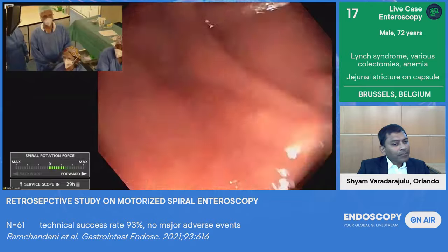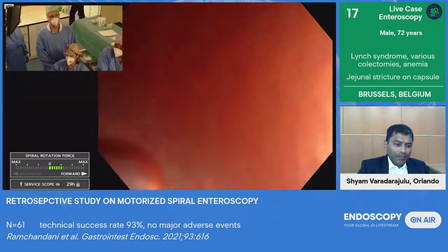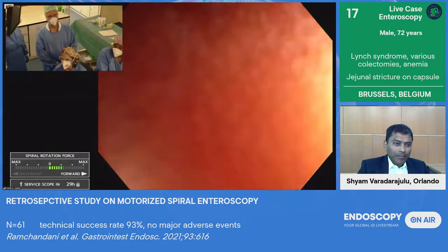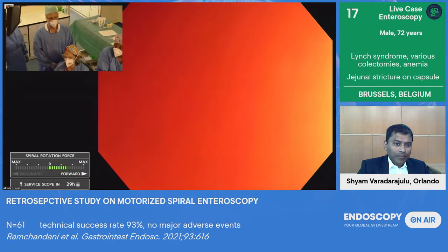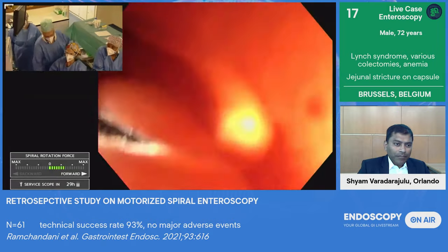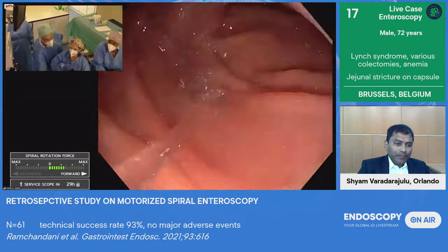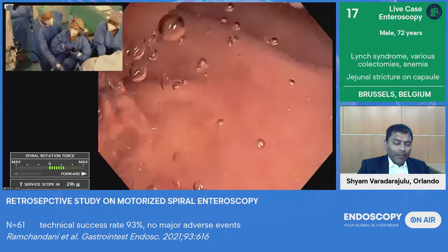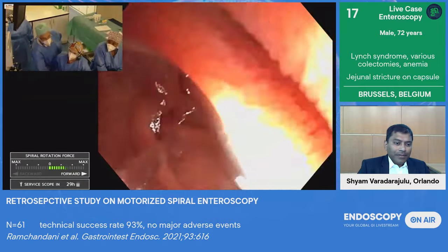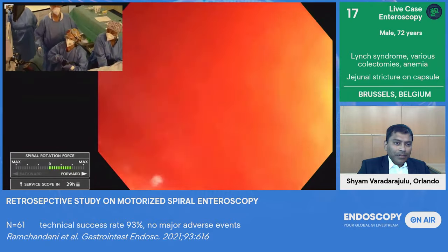Okay, now you see that Mariana is entering the proximal part of the jejunum. At this stage, she will mainly aspirate and flush, and continue to apply very modest pressure with the endoscope. You see that this can be even straight back. As long as Mariana is keeping the pressure, we can pull back the scope, and then we will be in a better position.